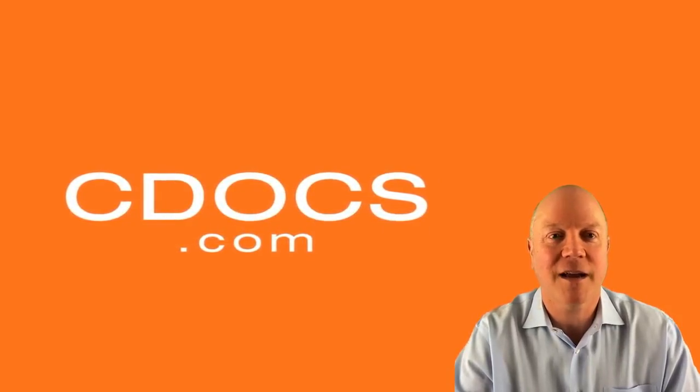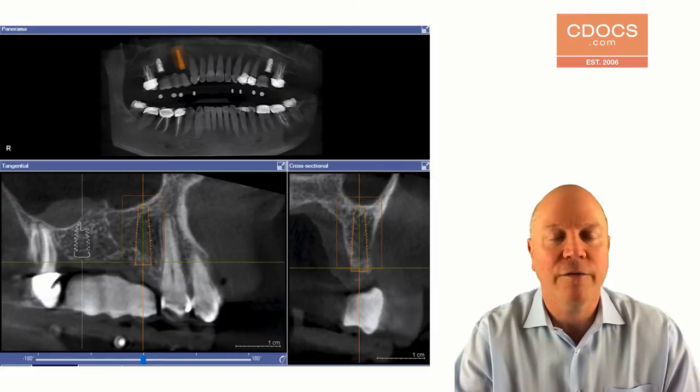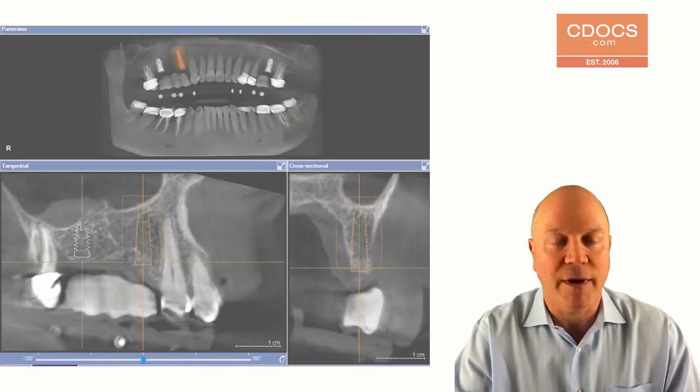Hi, this is Dr. Doug Smail with cdocs.com, and this tip of the day video is on how to use your surgical guide for stage two uncovering. This is a pretty basic case — it's a barium guide, a classic guide to do two implants for a three-unit bridge from three to five.